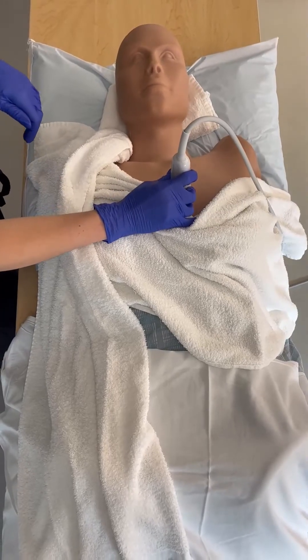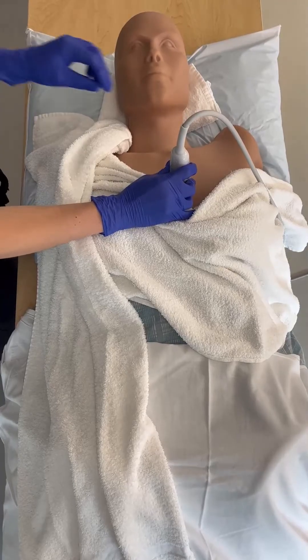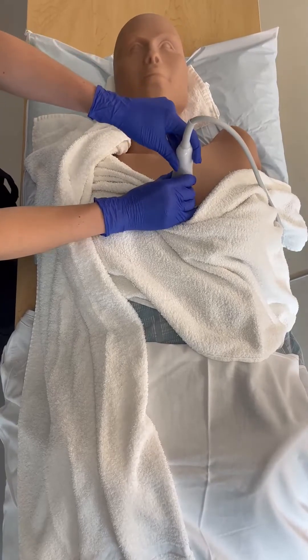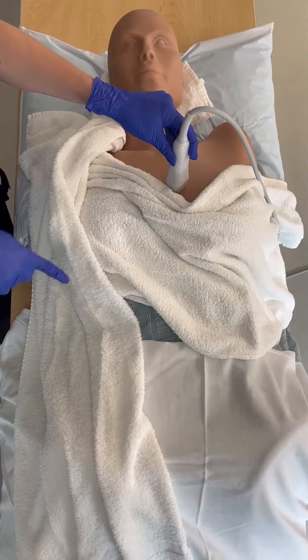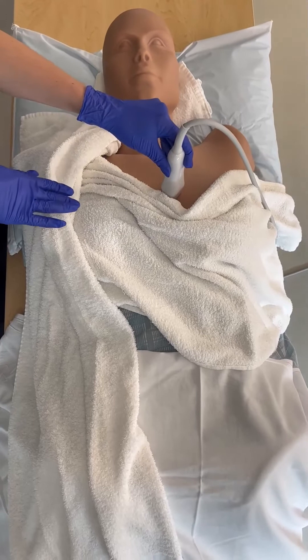Once we find our parasternal long axis view, we don't need to move the probe to get the short axis view. We'll just rotate the probe 90 degrees so that the probe marker is now pointing towards the patient's right hip. The probe is still on the left side of the patient's chest and the patient is still covered.